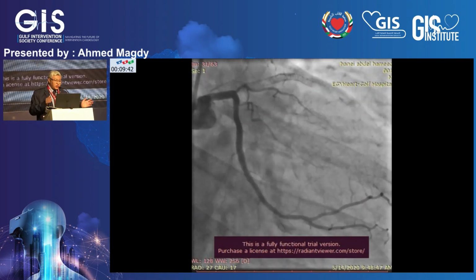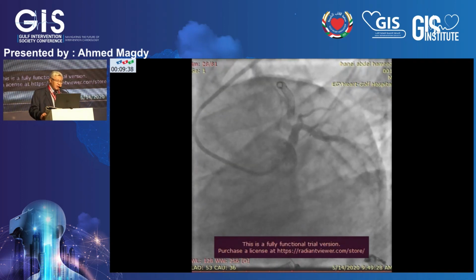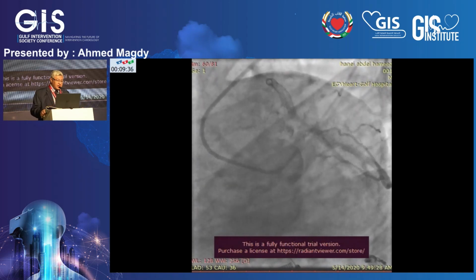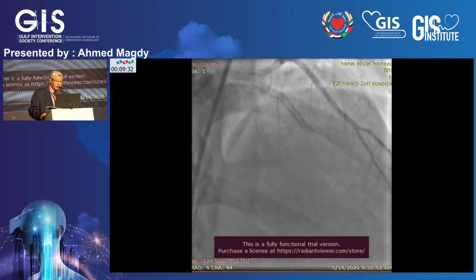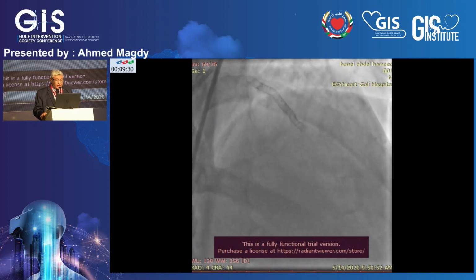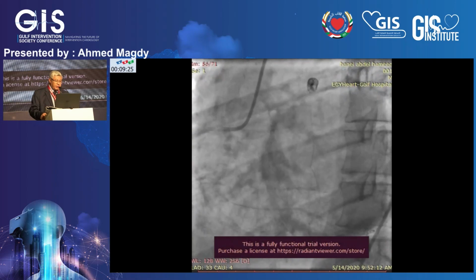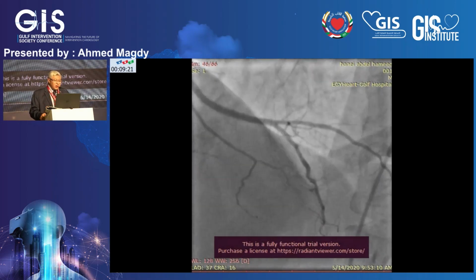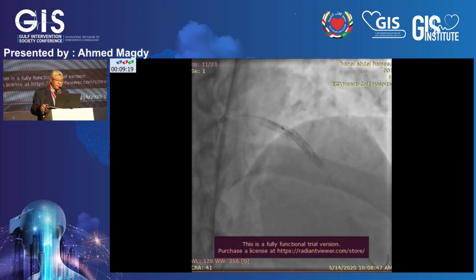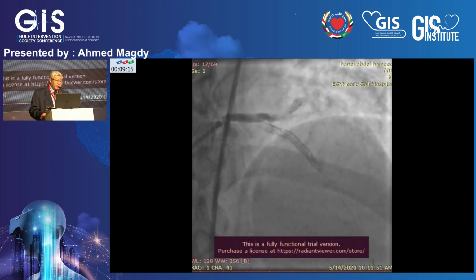So acute coronary syndrome may present in those cases with stent restenosis. It may present with angina, and they may present with acute infarction like these patients. And so take into consideration these multiple stents. This patient is liable for many complications. He had actually no reflow after we put a stent in the distal part, and we had to put DCB in the proximal parts.